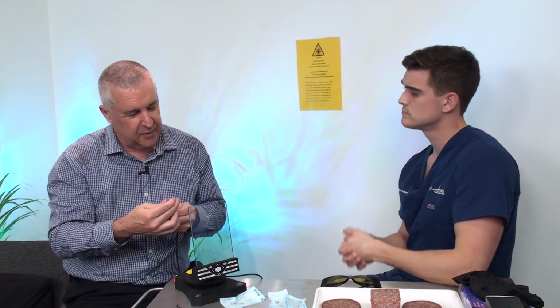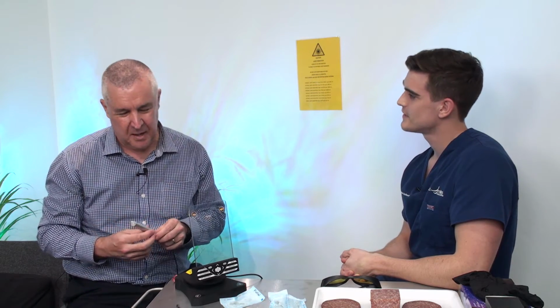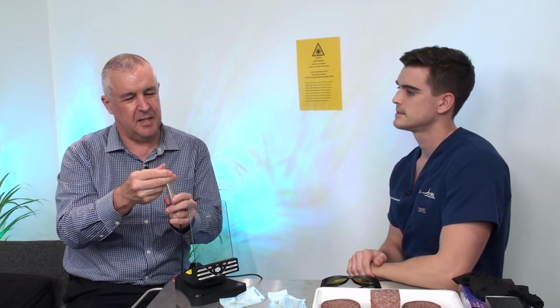Also for gingivectomy and tidying up the gingival margins when you're doing an aesthetic case, for example. That sounds like you've left the land of submarine dentistry behind, which is really important. That's great. Good. So I've just been putting a tip on the laser.